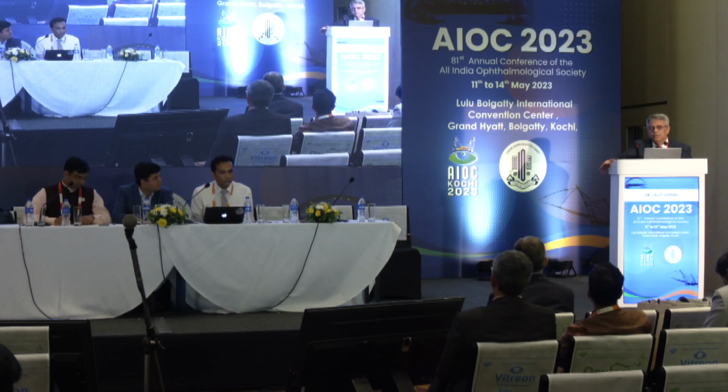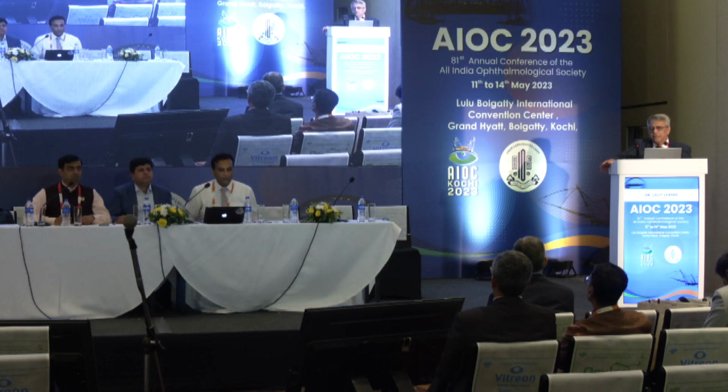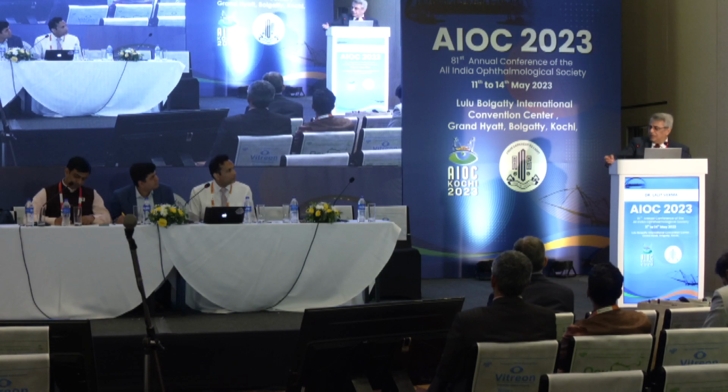Although I do not have too much data on this, I hope a lot of data will emerge, and it does help. I do not do IVTA, but in patients where we inject IVTA, I do not insist on complete removal. Let those crystals deliberately remain there, and then they may have an anti-inflammatory effect.